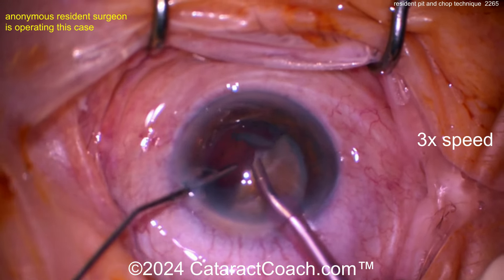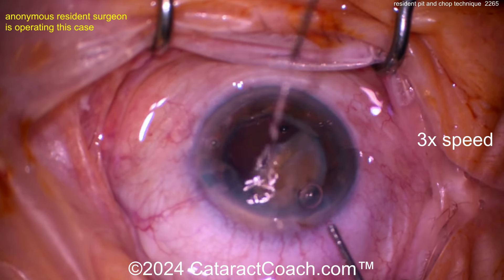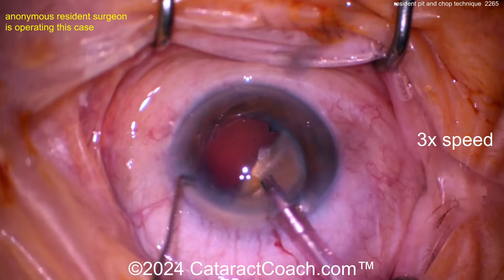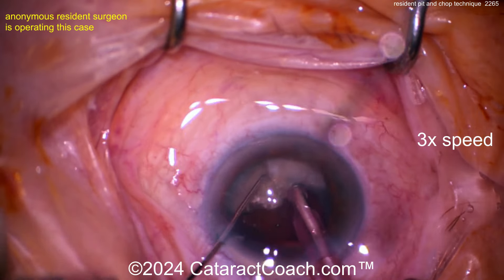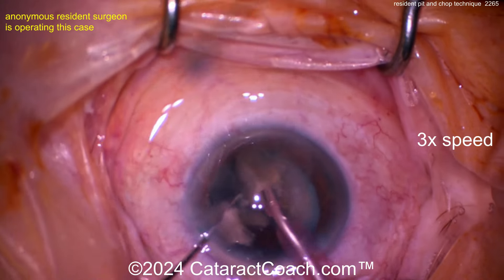So far my pearls for improvement — nothing so far, it's pretty darn good. Just rack up more and more experience. Very nicely done taking out the pieces of the first hemi-nucleus. Good pivoting technique. A little more viscoelastic in the bag to protect the endothelium and keep the bag stable as you get the last piece out. Remember there's no cortex here, very little epinucleus — it's all this big dense nucleus. There's a chop again, taking these pieces out.